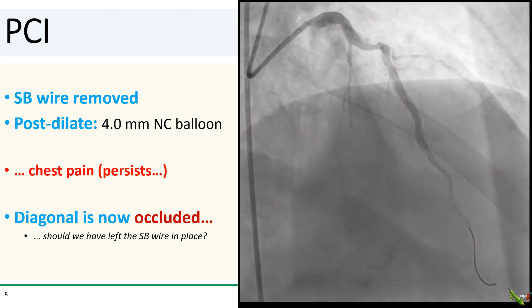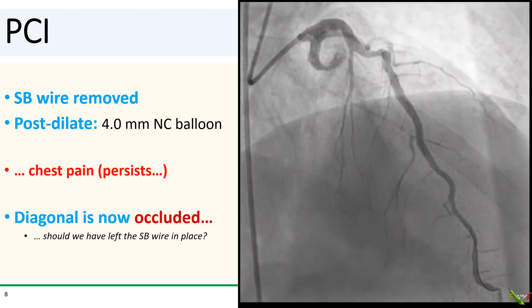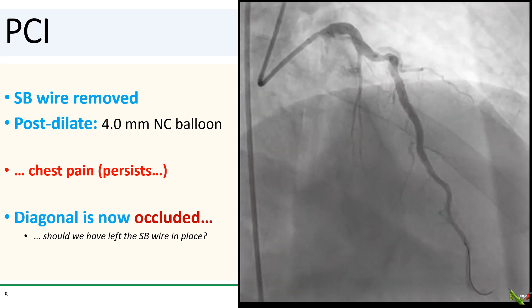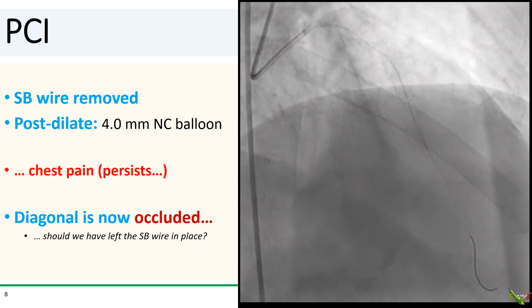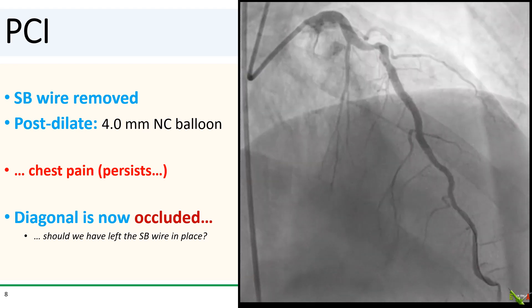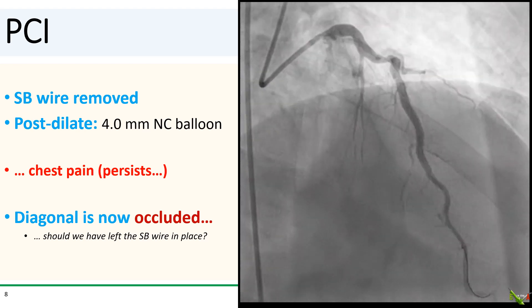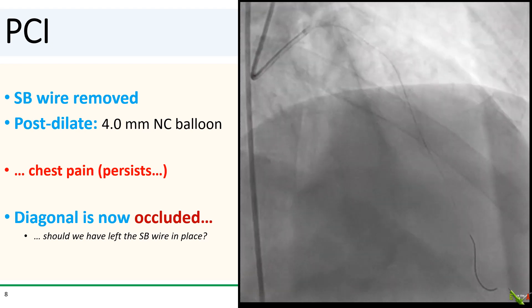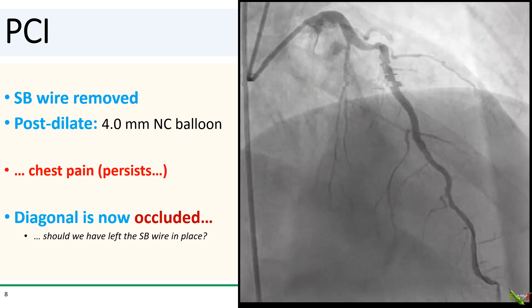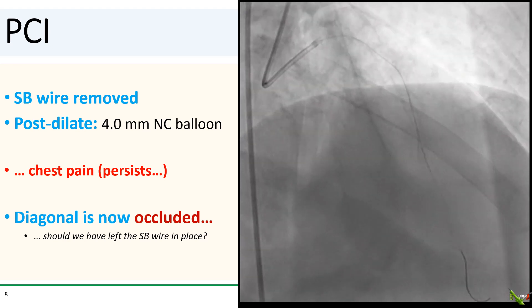As planned, we removed the diagonal wire and post-dilated with a 4.0 NC balloon. The patient developed a lot of chest pain during the balloon inflation, which we expected, but the chest pain persisted well after we deflated the balloon. We took a shot, and as you can see, the diagonal is now occluded. I did a lot of second-guessing after this — should I have left the diagonal wire in place before post-dilating? Frankly, I'm not sure. I've generally removed the side branch wire before post-dilating to reduce the chance of the wire getting stuck.